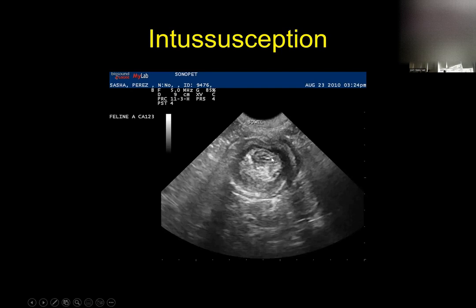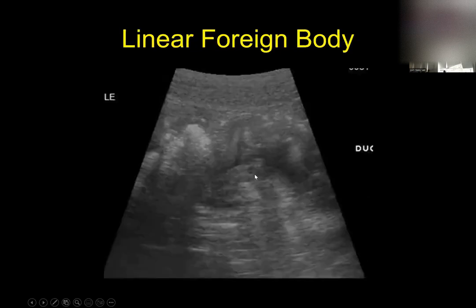This is an intussusception. And again, ultrasound is great for diagnosing intussusceptions. You can't miss it. There's not much else that looks like it. Okay. So here you can see there's a bowel loop right in here, and this hyperechoic mesentery is surrounding that bowel loop. Well, this whole thing is surrounded by another bowel loop. Okay. And that's classic intussusception. Again, there's nothing else that really looks like that. And the most common spot for intussusceptions is always going to be in the ileocecal area. That tends to do this more commonly than any other part of the bowel.